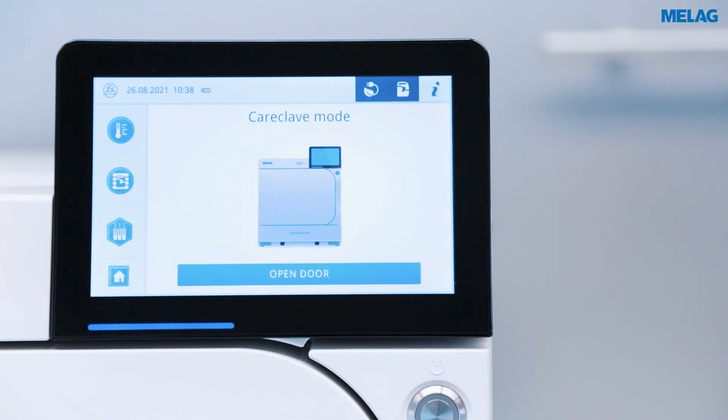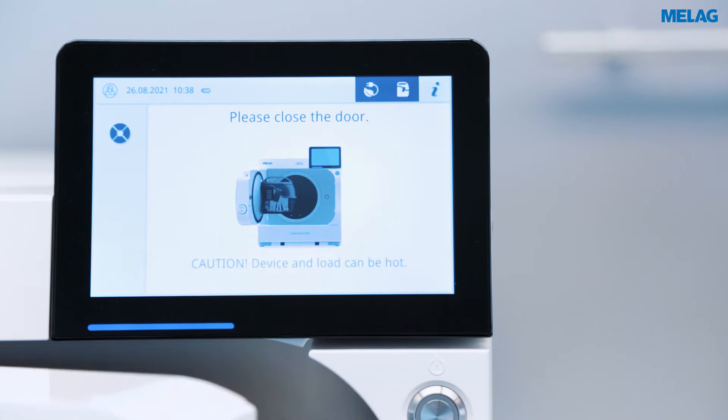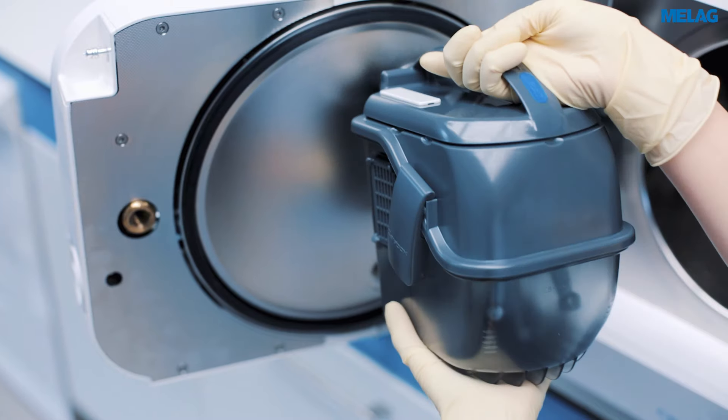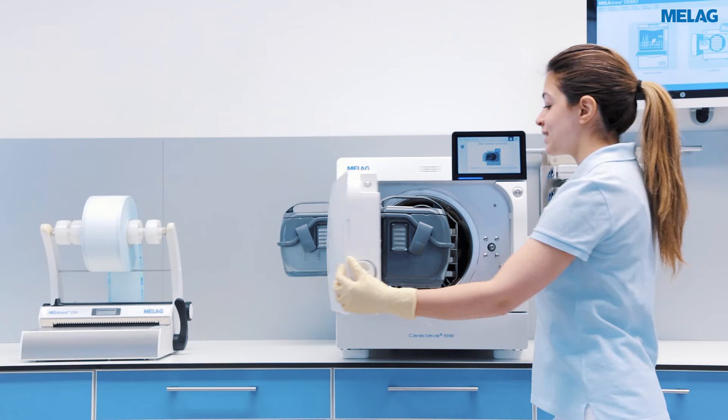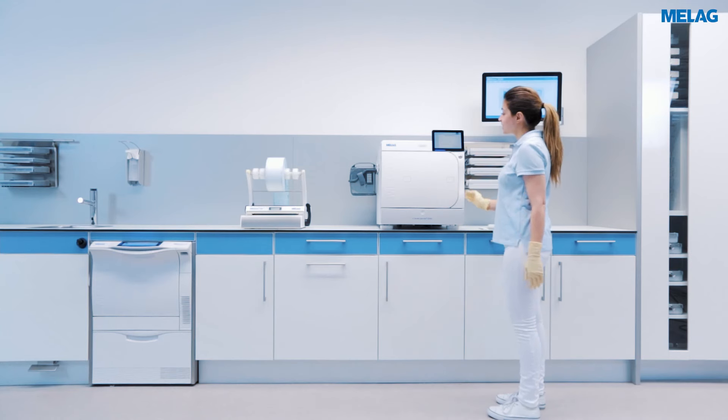You can open the door of the Careclave on the home screen. To close the door, please press it until the automatic door lock engages.